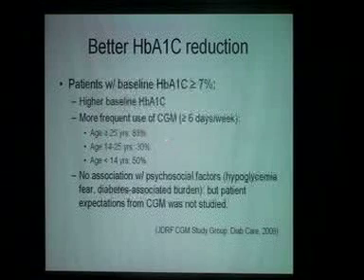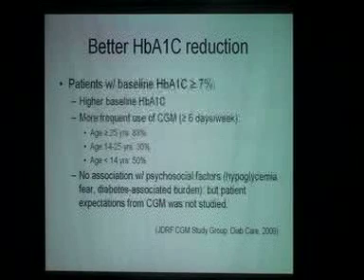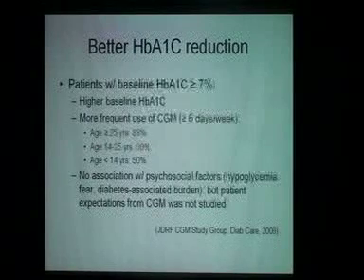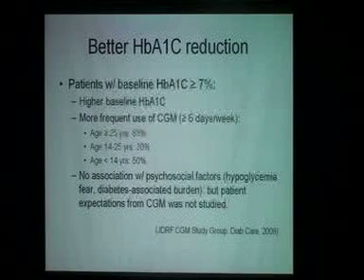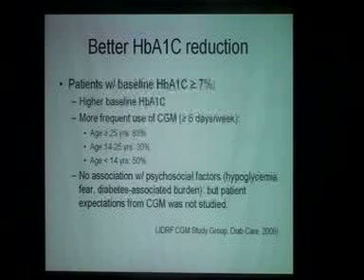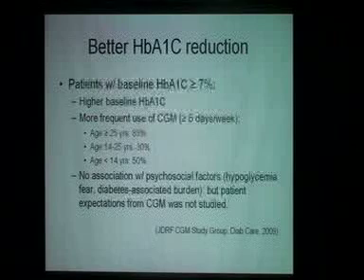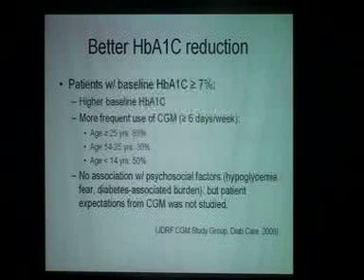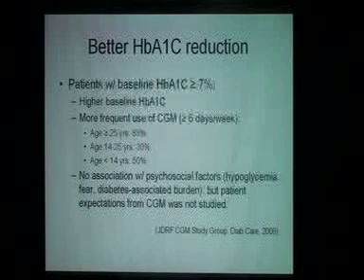So who used it the best? Adults, about 83% of them at the end of the 6 months still were wearing their CGM for 6 days. Kids younger than 14, about half of them. Teenagers, only a third. So, bottom line, not surprisingly, the ones that were more motivated or got better results in the first month, they kept using the CGM for the whole 6 months of the study, and they got better reductions in their A1C.